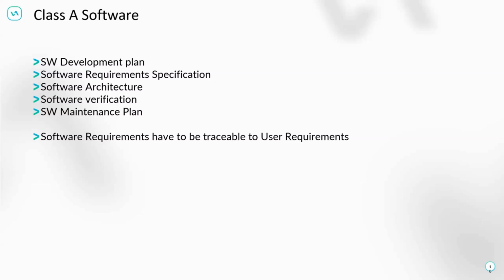You also include there things like how you release your product, how you can do that technically as well as virtually, and also how you deploy it. Is it an app store? Some companies still use DVDs and CDs to deploy products, and all that kind of stuff, how it will be created. So that is the first level, and then there comes something which is not very often used.